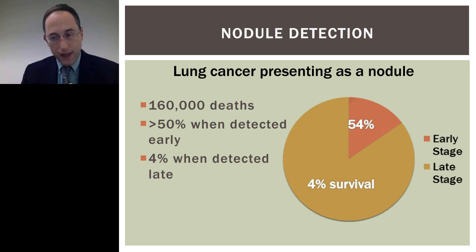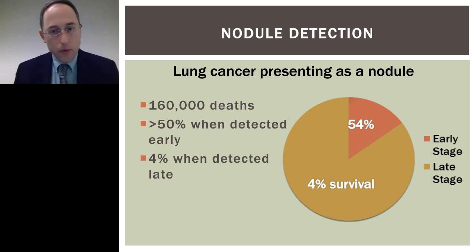you think about how every time a patient has an encounter with healthcare and they get imaging of the chest, in terms of looking for whatever the immediate clinical question is, you also want to look and make sure this person does not have an occult cancer. And if you catch it early, it can really make a difference for the patient. So I'm not talking about screening patients with tomosynthesis. I'm just saying as patients come through, tomosynthesis can detect nodules, and it's important to look for these things.